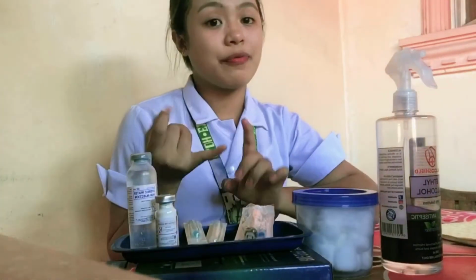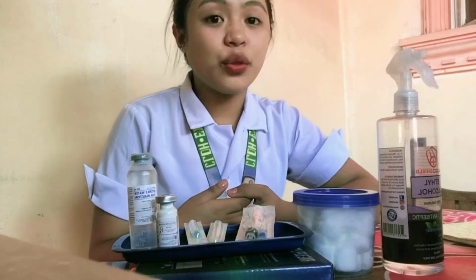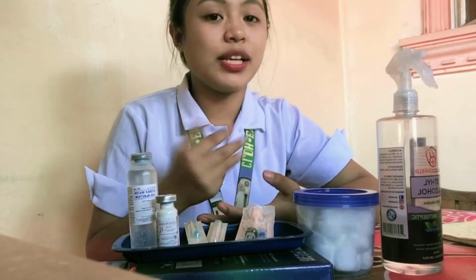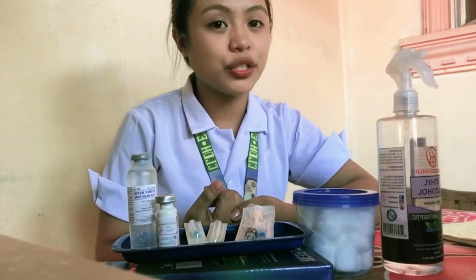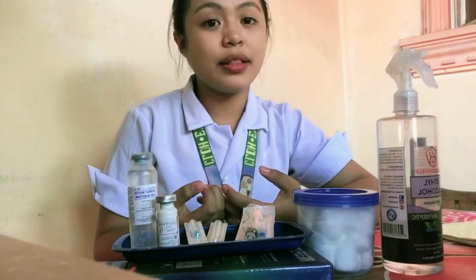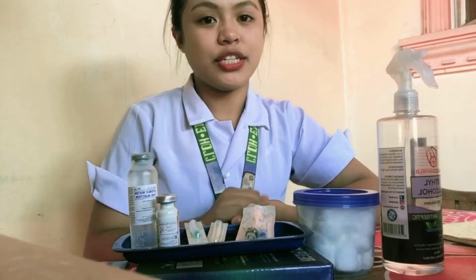After performing hand hygiene and preparing all the things that we need, we need to make sure that all the things and medication that we have are correct and match our MAR, or the medication administration record, or the doctor's order. If we are clear, we can now proceed with our medication.